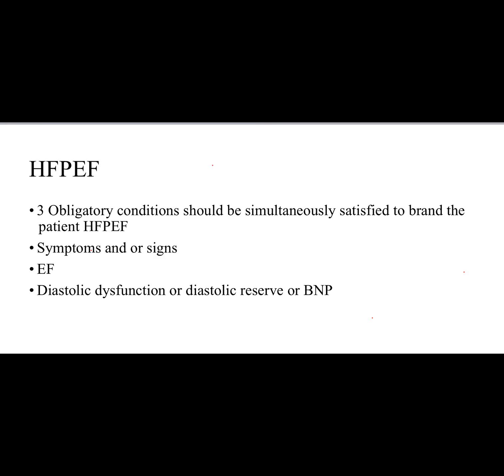By exercise. So now, starting from 2016, the new guidelines include the so-called diastolic reserve assessment, which is diastolic stress testing. Remember this one.